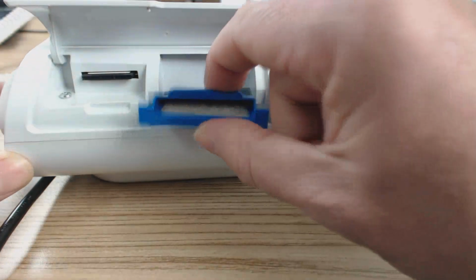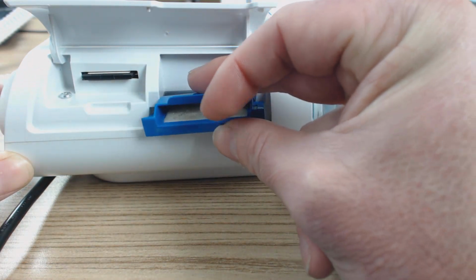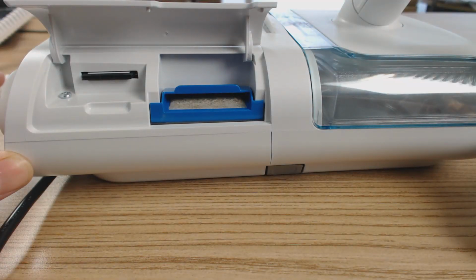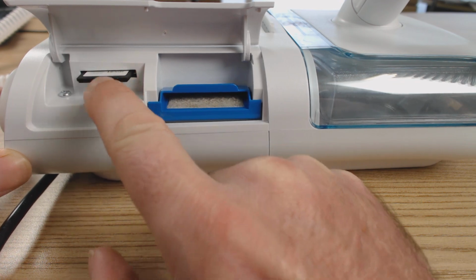I recommend you get those ultra fine ones as well. Put them on there. It's going to make sure that no dust gets into your machine or into your lungs. You know, it's going to be ultra purified air, which is what you want. You also get your SD card here as well, so you can push that in and take that out.